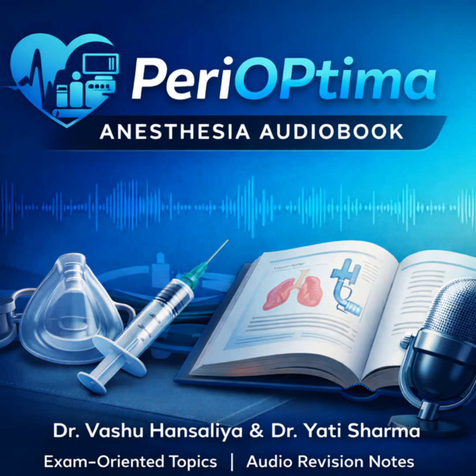You do. If the Bodok seal is missing, or it's split, or just put in wrong, high-pressure gas will leak out. A loud hiss. A very loud hiss. And that rapid leak doesn't just waste gas. It can lead to the rapid and premature exhaustion of the cylinder supply, which is especially critical if it's your only O2 source. Okay, so we've covered the small E cylinders.